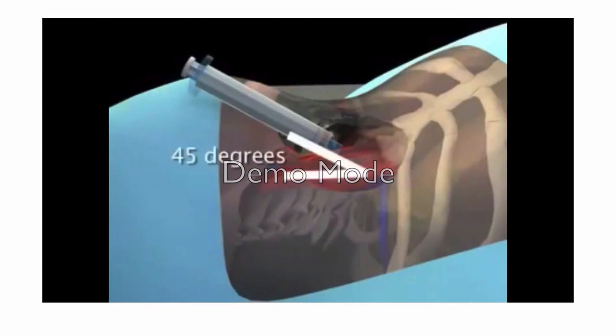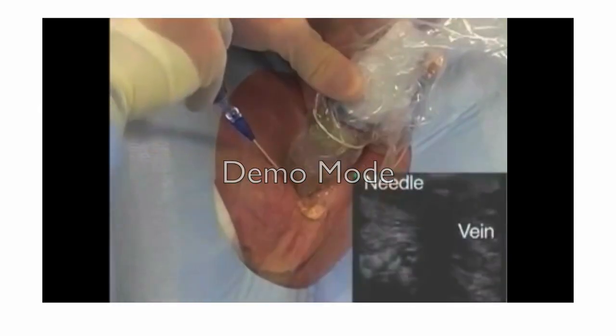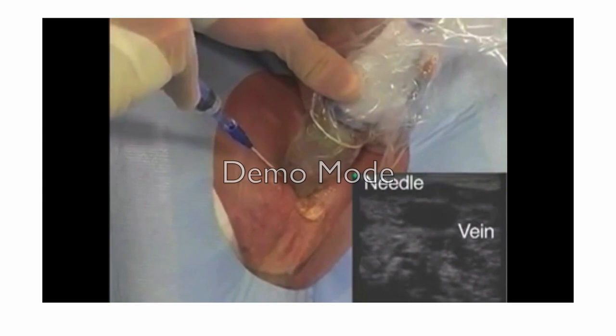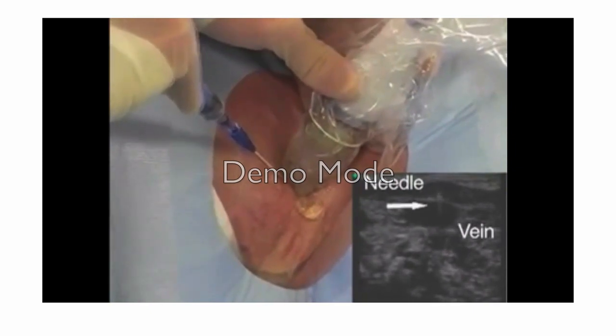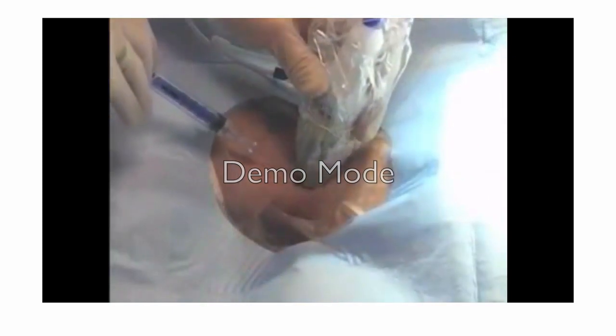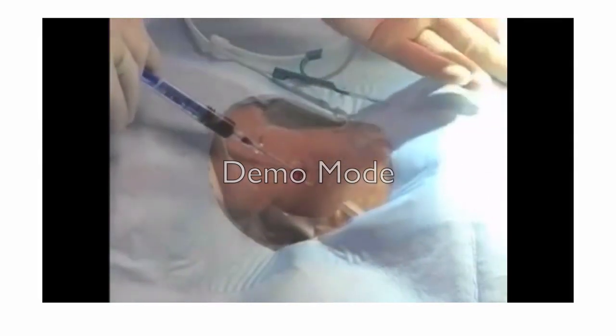and with your inserting needle at a 45 degree along the direction of the vein, and with the help of the ultrasound, apply negative pressure while you are inserting your needle till you hit the vein. Once you hit the vein, there will be a backflow.